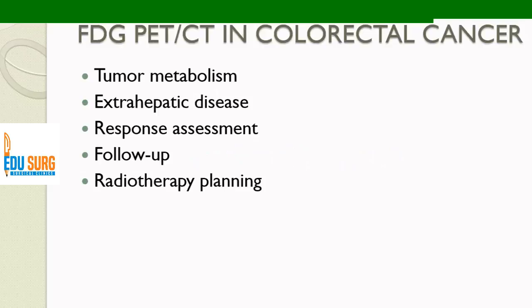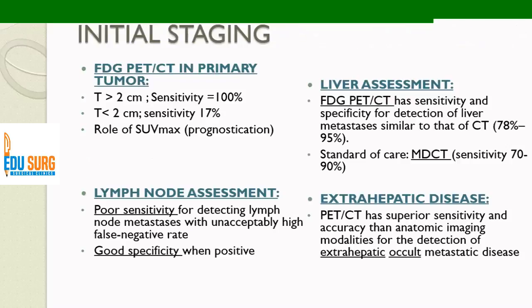It has a role in prognostication, which Dr. Raj very well elucidated is very important. Extrahepatic disease in the metastatic setting, response assessment in neoadjuvant therapy setting, any role in follow-up, and a role probably in radiotherapy planning, which is a new arena even in the PET-CT purview.